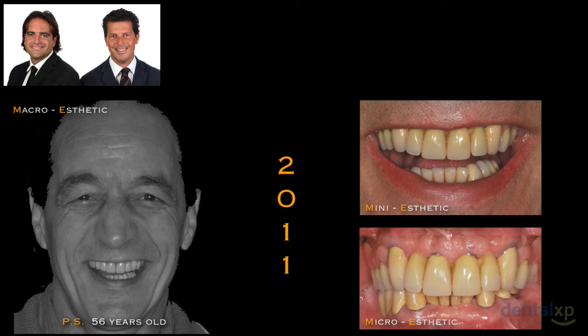And from here we can start seeing a lot of things. For example, we can see that the dental midline is canted toward the right. We can see that Sergio has a low-high smile line.